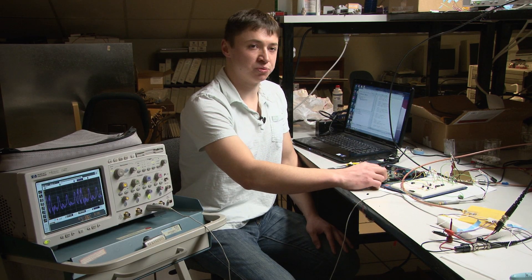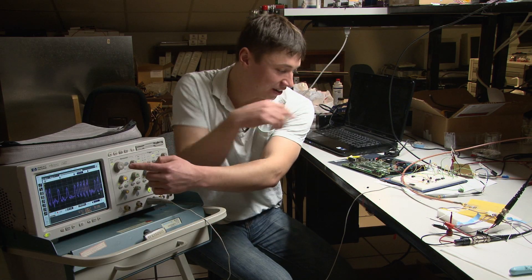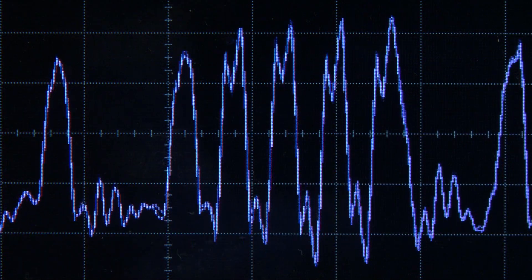By turning the different switches, we can tell the device to either go forward, turn left, or turn right. And we can see the data is changing on the device here, on the oscilloscope, by changing these switches.